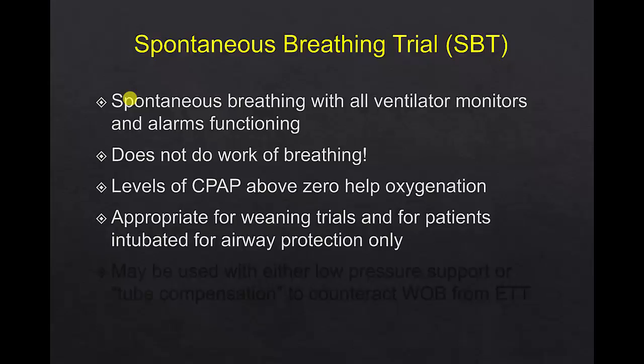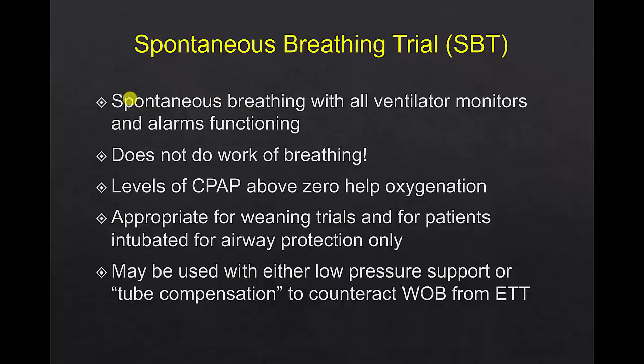Spontaneous breathing trials are appropriate for weaning trials and for patients who are intubated for airway protection needs only. Spontaneous breathing trial may be used with either low pressure support or what's called tube compensation on some ventilators to counteract work of breathing from the endotracheal tube or the tracheostomy tube.